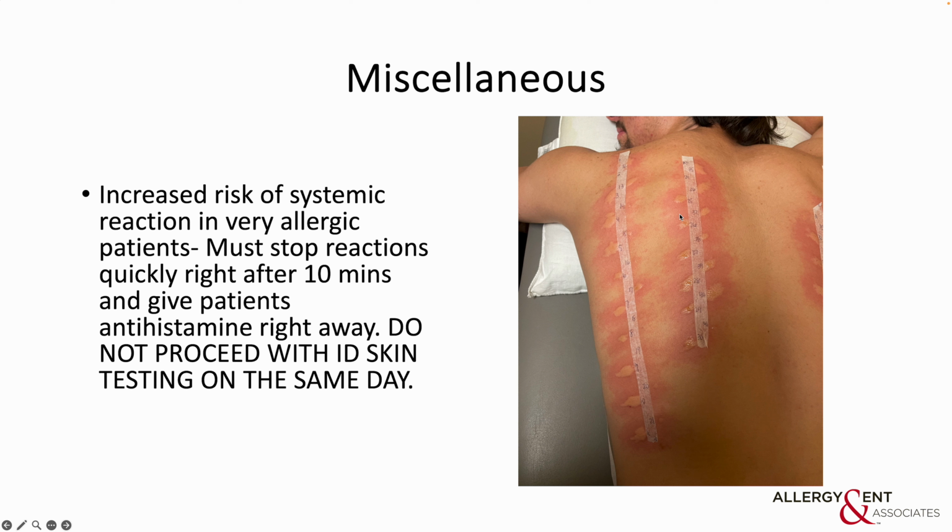So this young man, he is very allergic. This is a 10 minute reading. He got a bunch of pseudopods. All of these are grade 4. You can read it now easily without measuring. Actually for this patient, the MA called me, and before she let him sit up and read the test, I gave him 2 Zyrtec. Sometimes you can do a Zyrtec and 1 Benadryl. Benadryl works faster, within 10 minutes. Zyrtec takes about an hour to start, but Zyrtec lasts longer, while Benadryl only lasts about 4 hours.